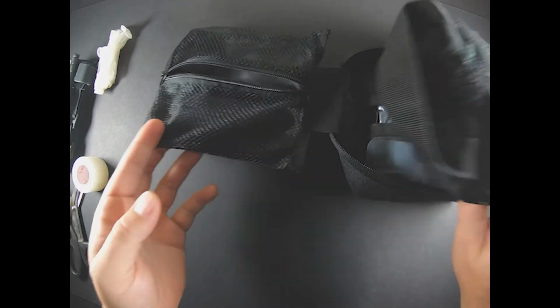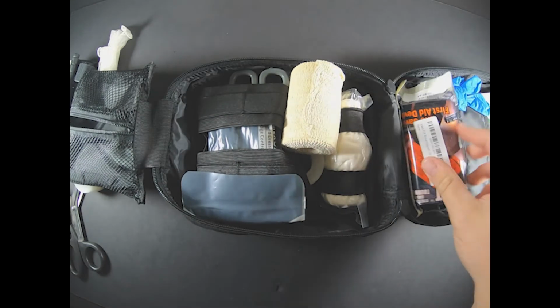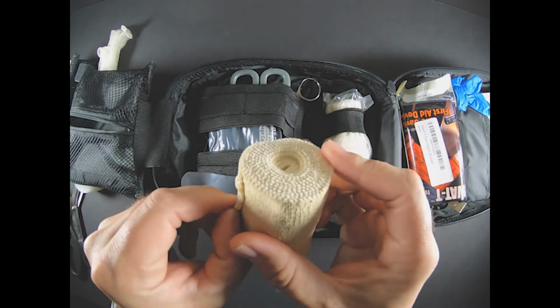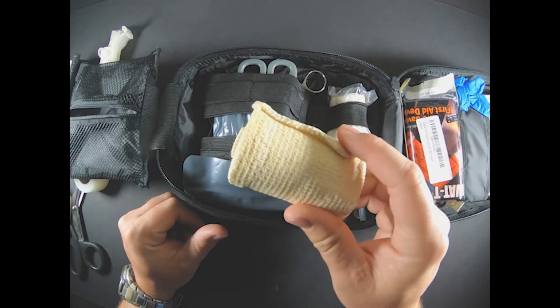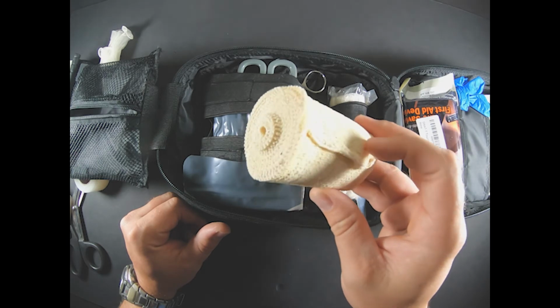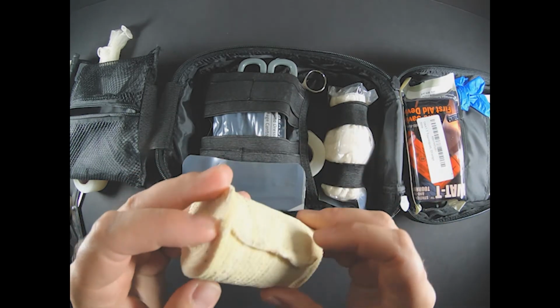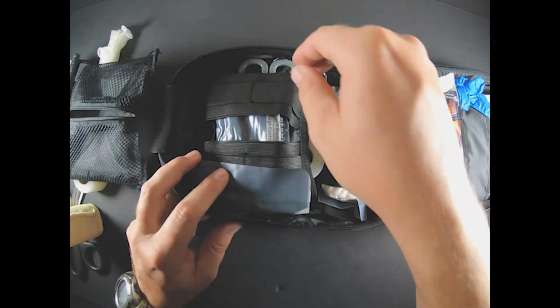Alright, moving on to the next section, the middle section here. So this actually rides over here. This is a sticky bandage. It sticks to itself, so if you have any dressings that you need to make sure that they stay in place, that's a good thing to have. Also, very similar to the ace bandage, only the difference is this one sticks to itself, which is great. Doesn't really stick to too much other things in there, but you got that.